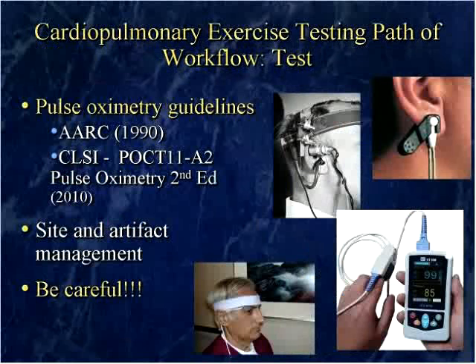Pulse oximetry during the test, a tremendous adjunct. It's been around forever. One of the pictures that I have there, the black and white, is from the Mayo Clinic back in the 1940s with the aeronautical unit here. We were actually the first one to do ear oximetry, not pulse oximetry, but ear oximetry, and then moved on from there. AARC has a guideline, but it hasn't been updated since 1990. The Clinical and Laboratory Standards Institute has a guideline that was published in its second edition in 2010. Greg Ruppel and a couple other therapists contributed to that particular guideline, and it's an excellent resource for you.